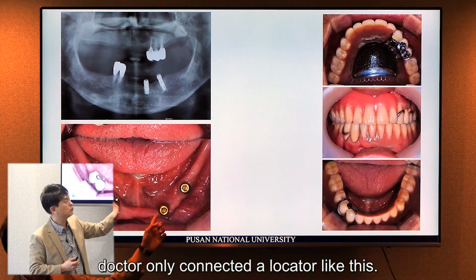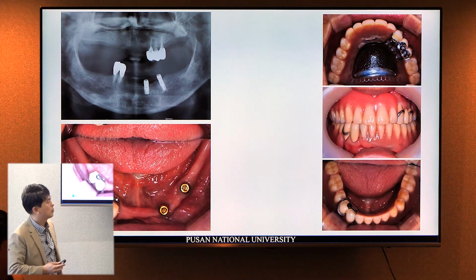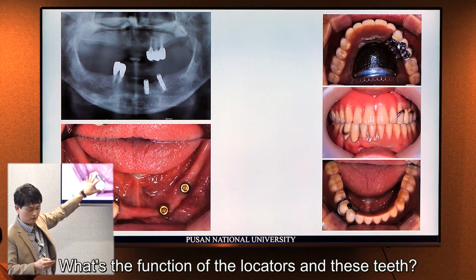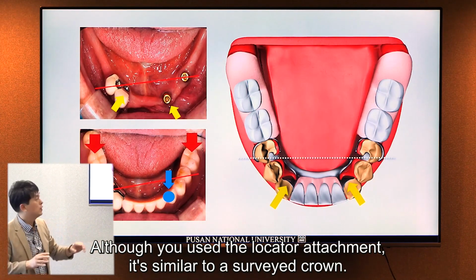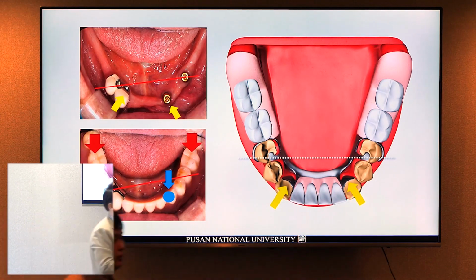The doctor connected with the locator right here, like this. So what's the function of this locator and these teeth? Although you use the locator attachment, it's similar to the surveyed crown. What I mean?